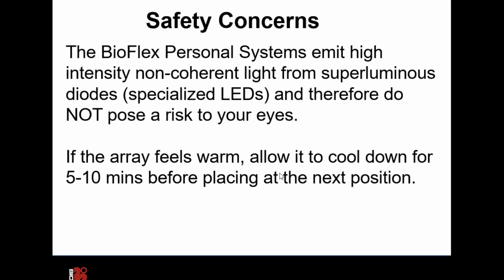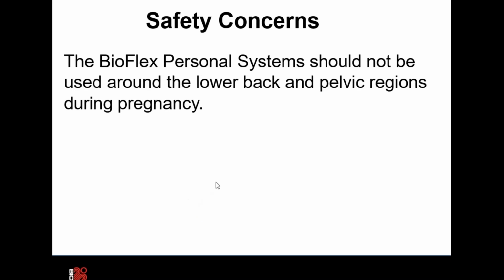So these systems are designed to emit high intensity, non-coherent light. They don't pose a risk to your eyes, so you don't need to be worried. If the array feels warm, so if you're using it consecutively, then just let it cool down for a few minutes, maybe 5-10 minutes, before putting it on again.